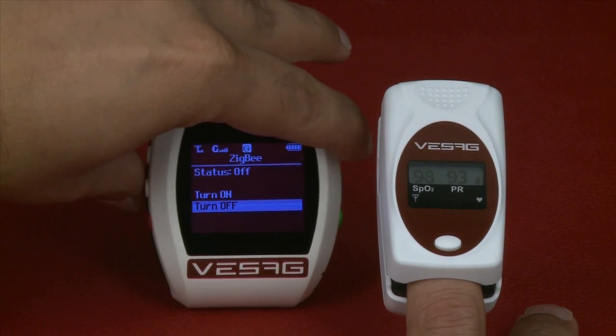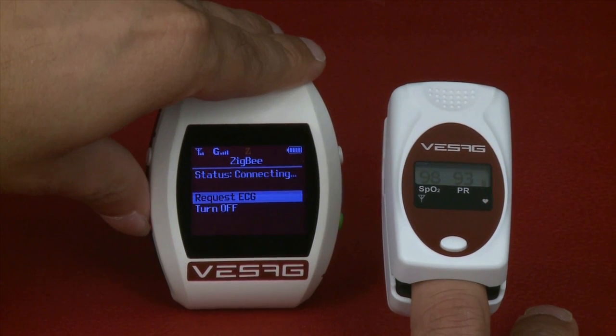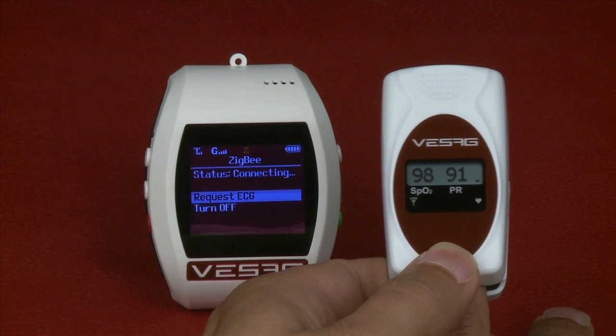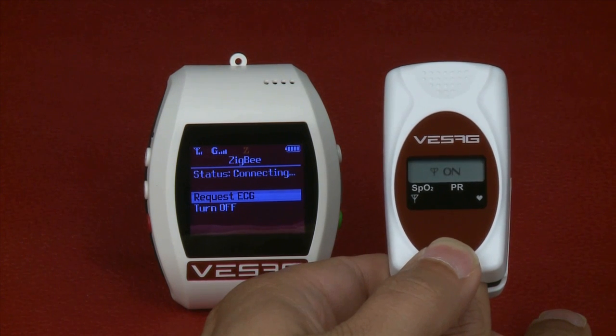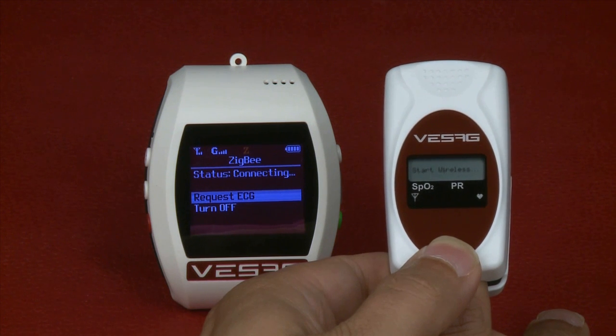Turn on Zigbee on the watch. Place your finger in the Oximeter. Press the button on it for a few seconds until it displays on, then press the button again until it says Start Wireless OK.